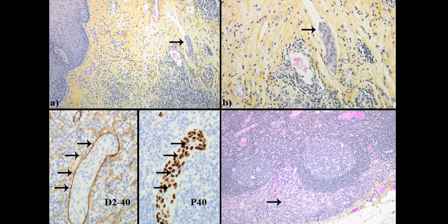In panel D, using the P40 stain, the squamous cell tumor cell nuclei within the lymphatic space are highlighted. And finally, in panel E, we can see metastatic squamous cell carcinoma within a lymph node.